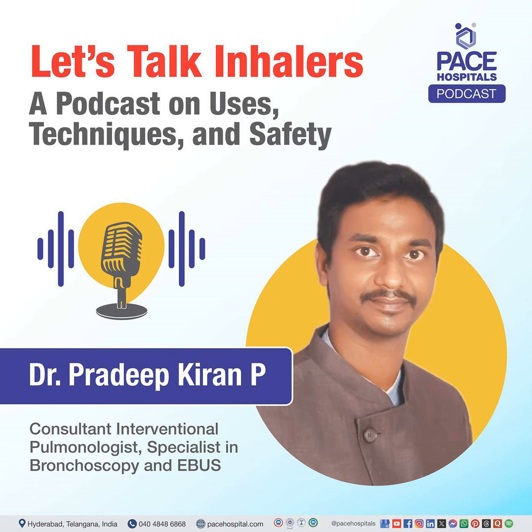Now, I told earlier that with an MDI without a spacer, you cannot press 2 times. But when you are using a spacer device, you can press 2 times. 2 puffs means 1, 2. Now the medicine is in the storage space. You can take it. Once you have finished inhaling this inhaler, close your spacer and keep it back.